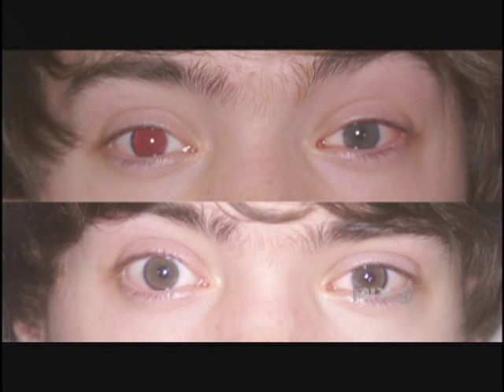All right, so here's another example. What do we have here? Right. So this is one of our most wonderful success stories. This is a patient who at the time was 17 years old. He had congenital aniridia, so he was born without the iris. Colossal amount of sensitivity to light, decreased vision. He was legally blind. And we implanted, you see on the photograph on the top, after we implanted his left eye, you see a relatively normal looking iris, and you see on his right eye, by contrast, how he was born. And on the bottom, after we've done his second eye.